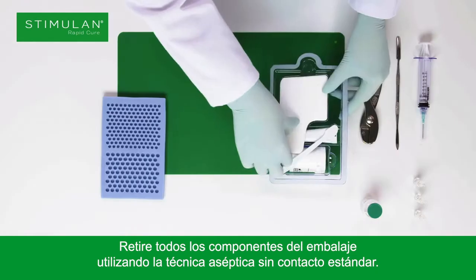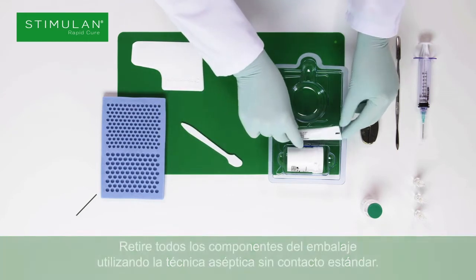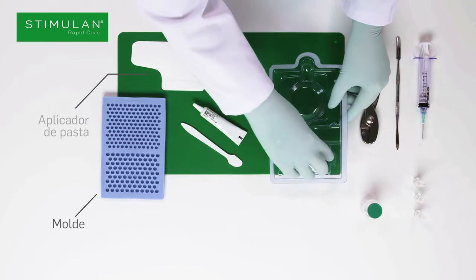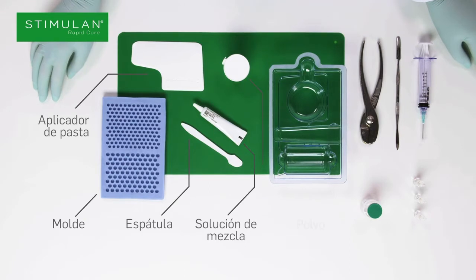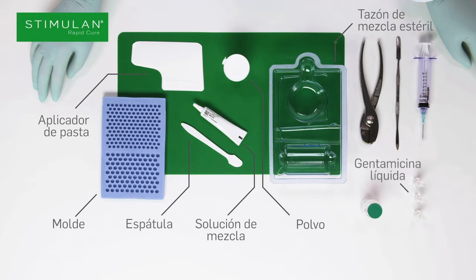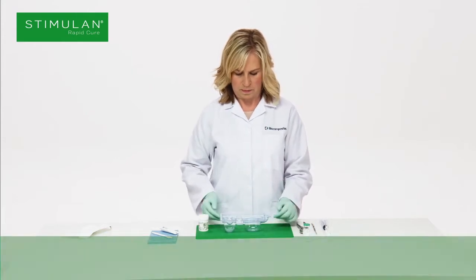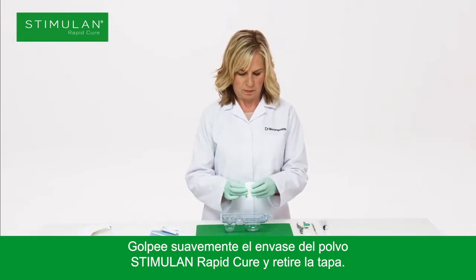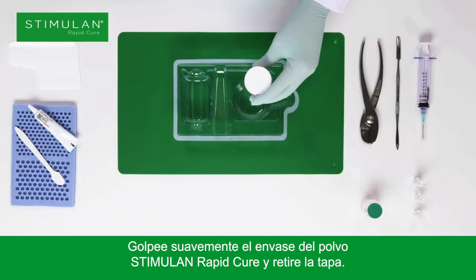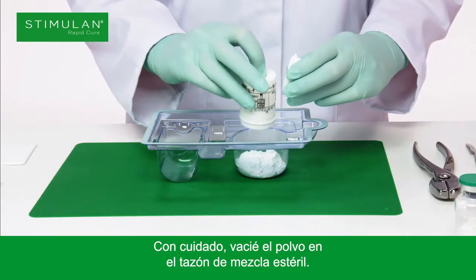Remove all the components from the packaging using the standard aseptic non-touch technique. Gently tap the pot containing the Stimulan Rapid Cure powder and remove the lid. Carefully empty the powder into the sterile mixing bowl.